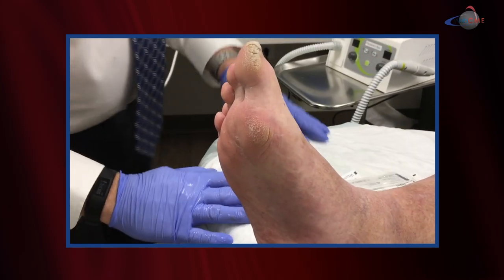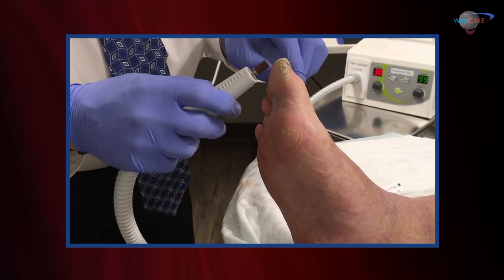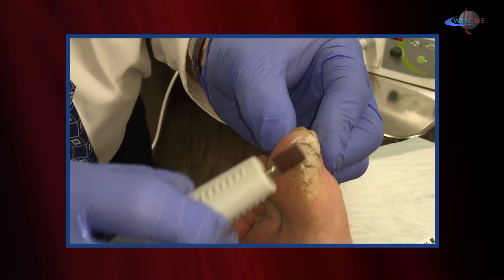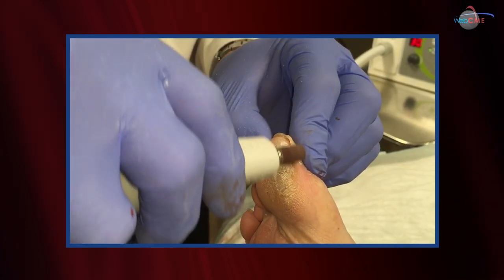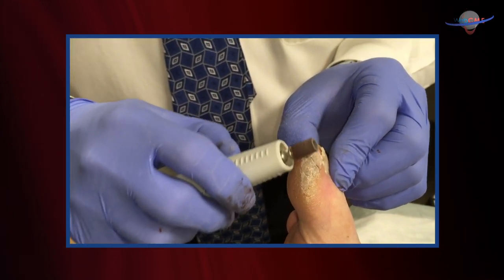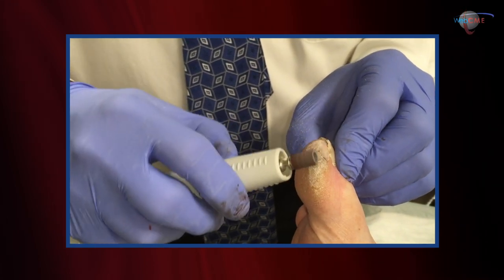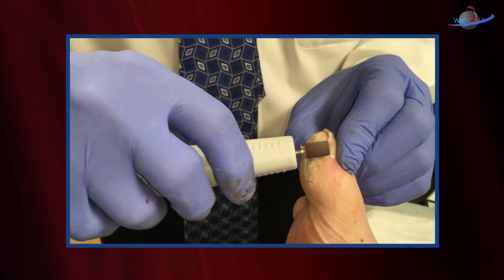Now let's turn our attention to this other area of callus. For this callus I'll oftentimes use a Dremel. This tool is very effective at taking callus down. You can see the fissures inside that callus — that's a problem. Callus is very hard and splits with repetitive traumatic episodes, which is what you see with daily walking. By taking that callus down, it allows the skin to heal, moisturize, and prevents it from becoming a problem.